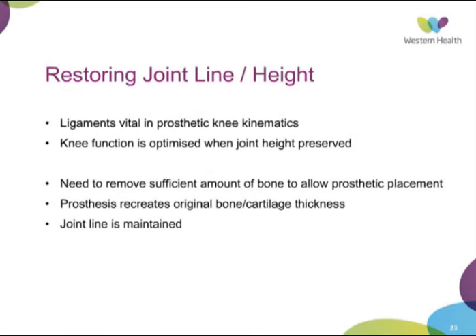So the second technical consideration is restoring the joint line or joint height. And this is because in an unconstrained knee replacement, the ligaments play a vital role in the kinematics of the knee. And it's shown that knee function is optimized when that joint height is preserved.